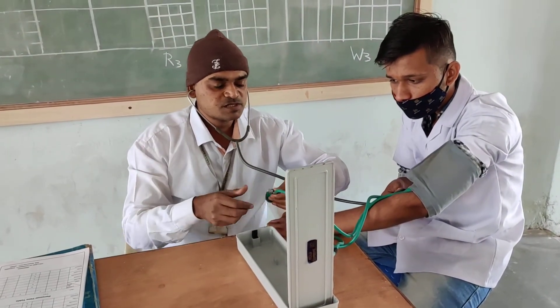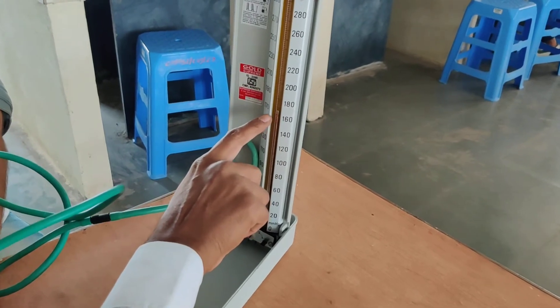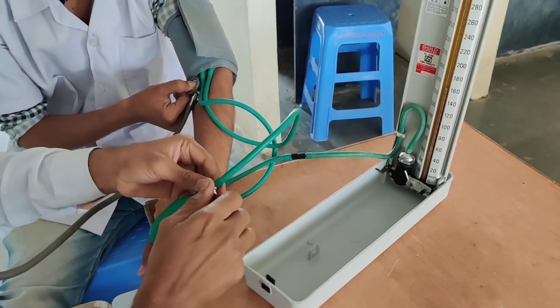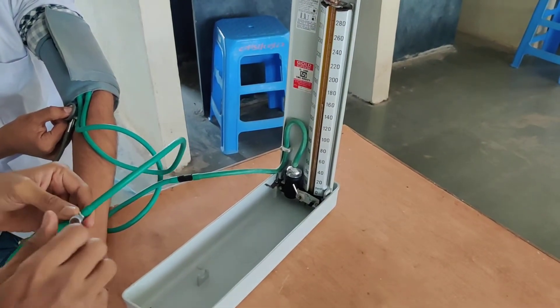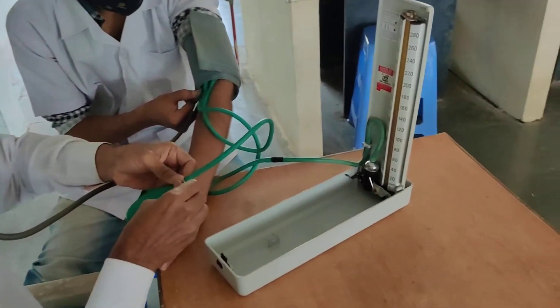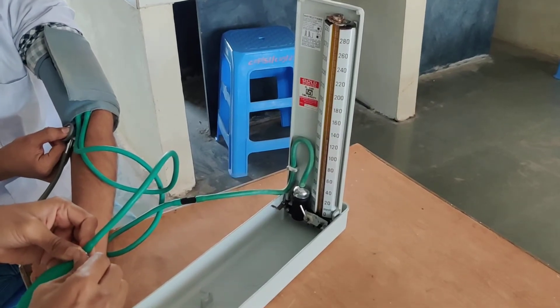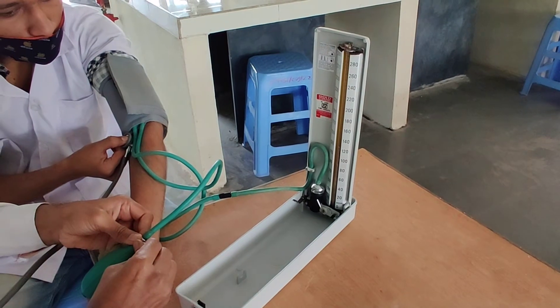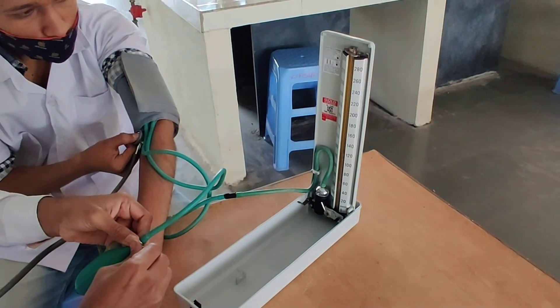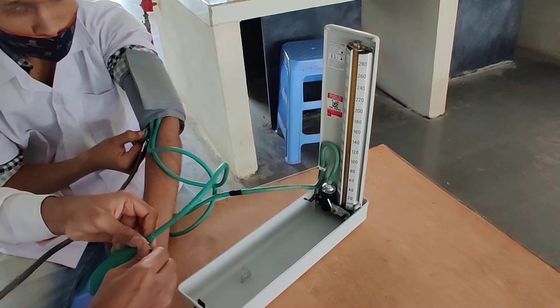Now I will slowly release the pressure. The mercury reading is at 160. We will slowly release the pressure and listen for the loud Korotkoff sound. Whenever we start to hear that loud sound, that is the systolic blood pressure. From 121, I am able to hear the loud sound, so 121 is the systolic blood pressure.